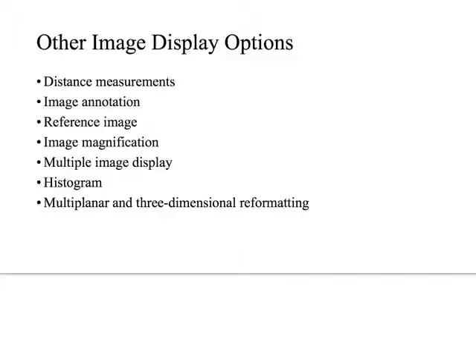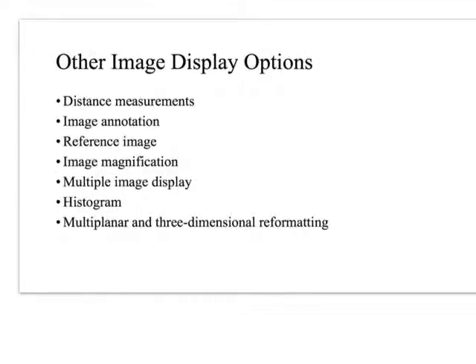And one thing to talk about with that mean versus standard deviation, the standard deviation can give me an understanding of how much noise there might be in this image, and also how well did I place my ROI. Like if I set the ROI kind of between to where I'm sampling both the kidney and whatever tissue is outside of the kidney, the standard deviation will be pretty high, because that attenuation value between the kidney and like the retroperitoneum is going to be pretty high, right? So I want to make sure I place my ROI right where I want it to be.